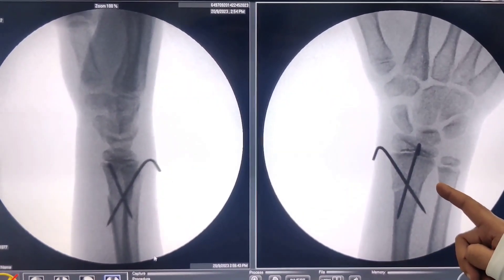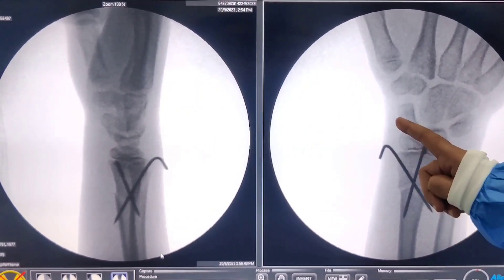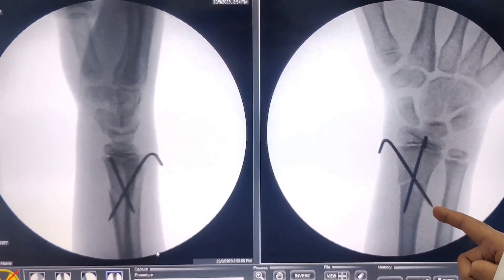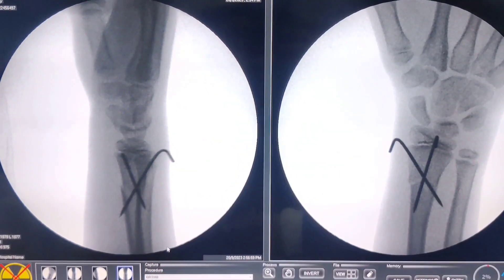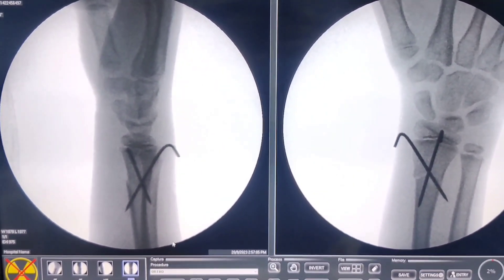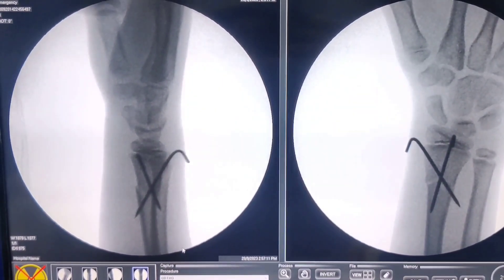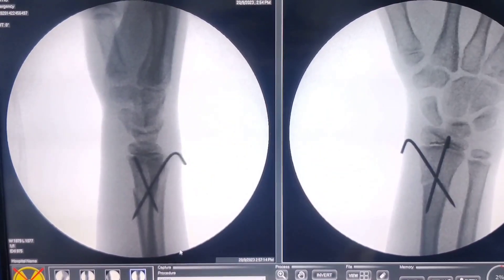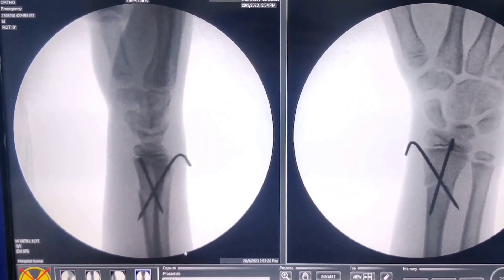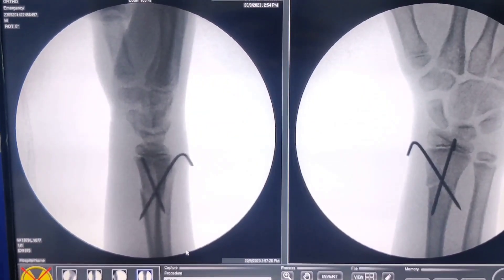Looking at the final images, this looks pretty perfect — everything looks good and we have avoided the physis. Even if you have to go through once or twice I do not think it does any harm, but avoiding the physis is slightly tricky and with experience you should be able to do it. Laterally there is a small step but it is negligible. The only advantage of putting the wire is that you do not need to extend the plaster above the elbow — a below-elbow plaster for 4 weeks is sufficient, after which you can remove the wires and get the patient going.